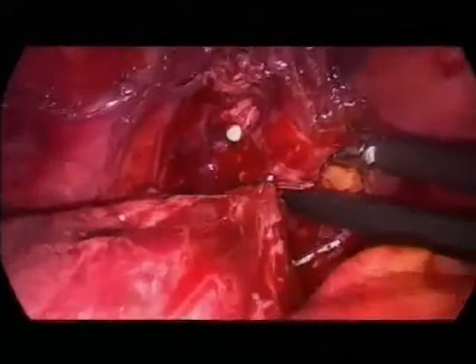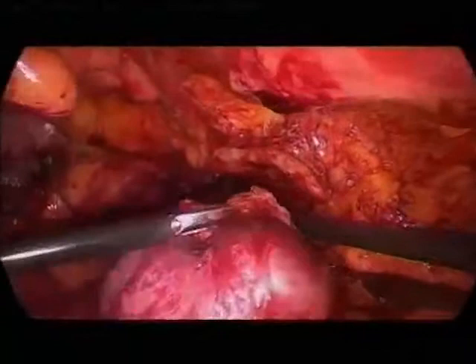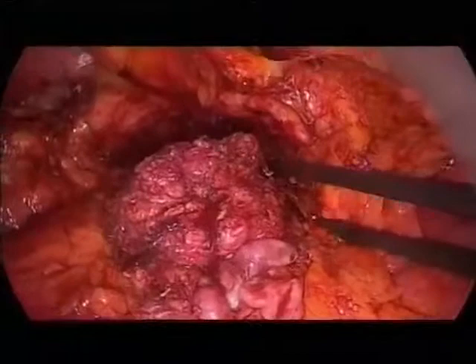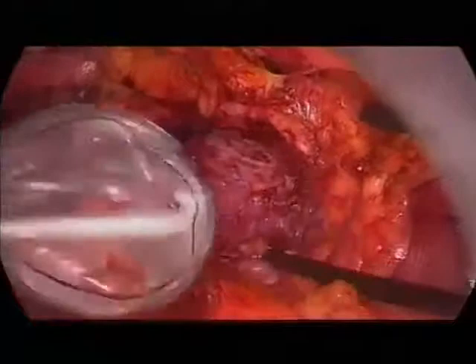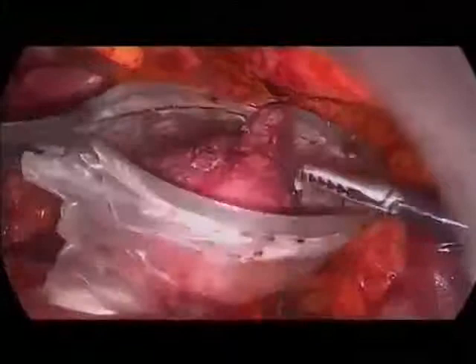Good. Okay, it's done. You see the apex looks very nice here. So we place the prostate now. Thank you very much. We place it now into an endobag. I wouldn't do a frozen section. It's really a nice apex. And I really think that it's recommended and the very classical now standard.